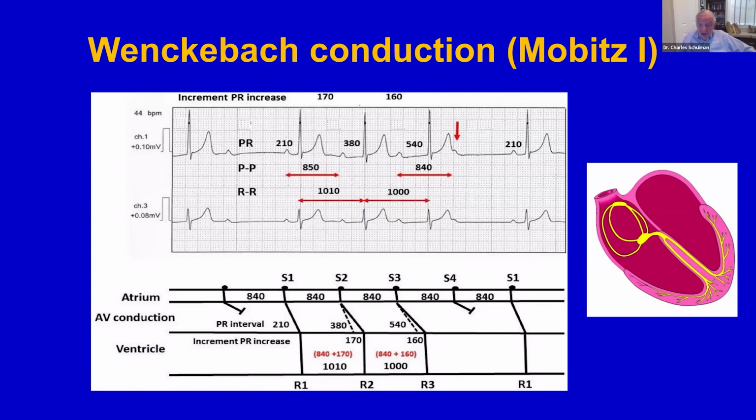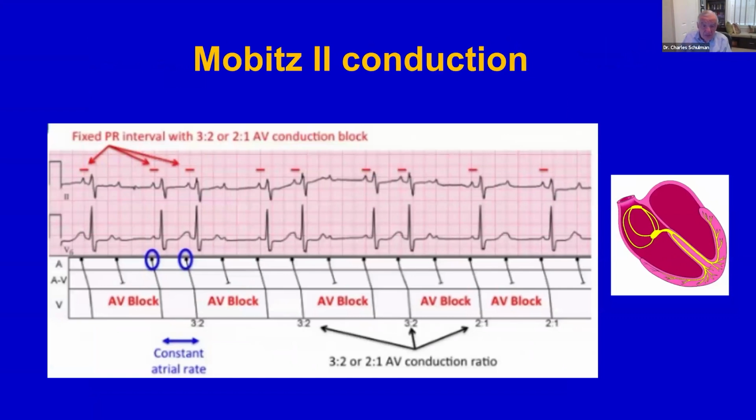Okay, so Wenckebach, or Mobitz 1, takes place in the AV node, so it's a matter of relative refractoriness. Here's Mobitz 2. Beats are either conducted or not conducted.